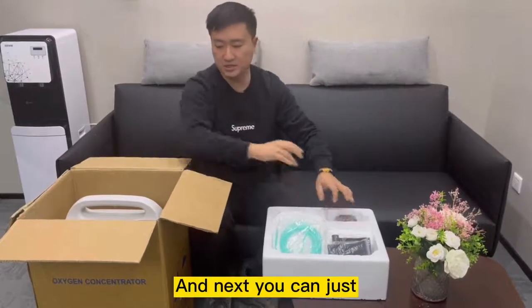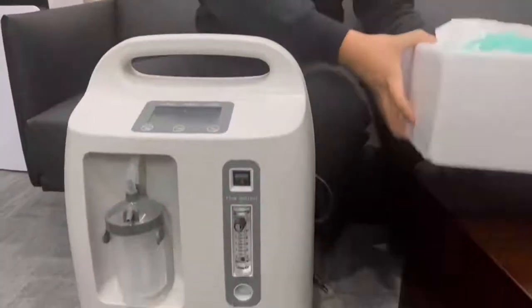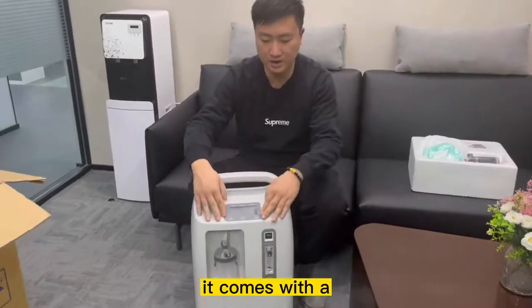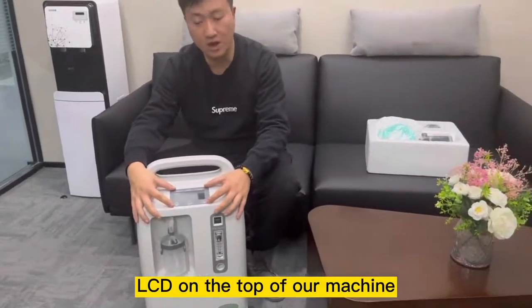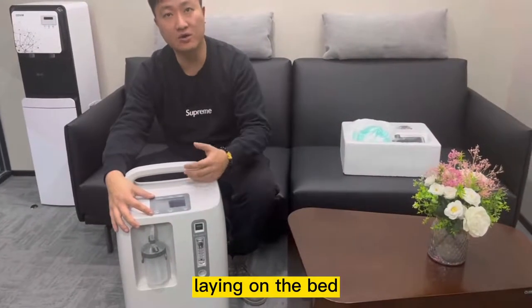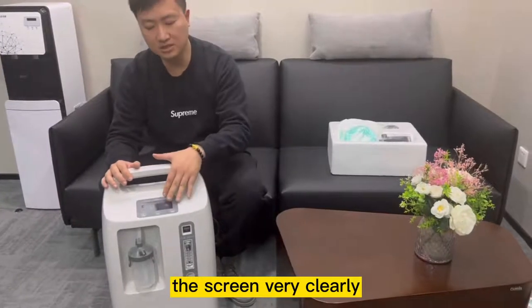Next you can just take out the machine itself. This is our ORV10S. It comes with an LCD on the top of the machine, which is very simple and convenient for people who are lying on the bed with the machine by their side — they are able to see the display very clearly.